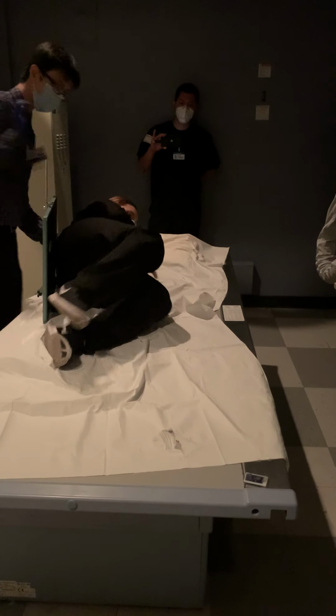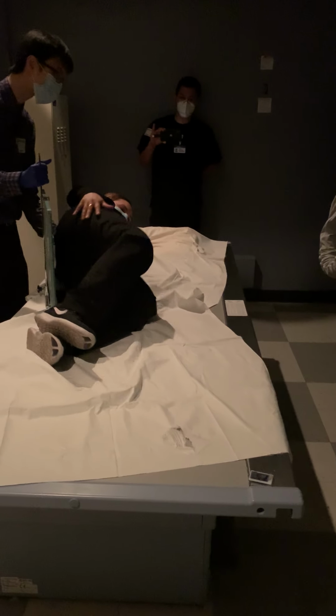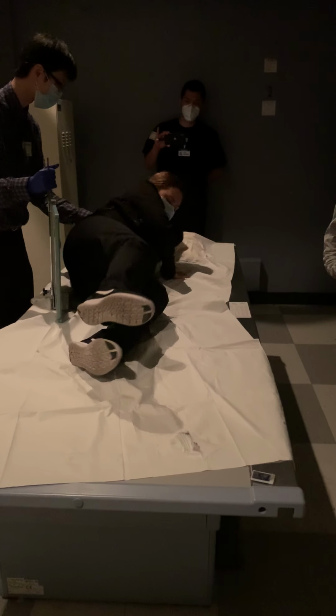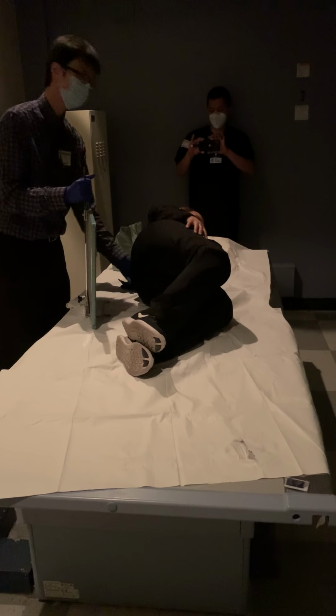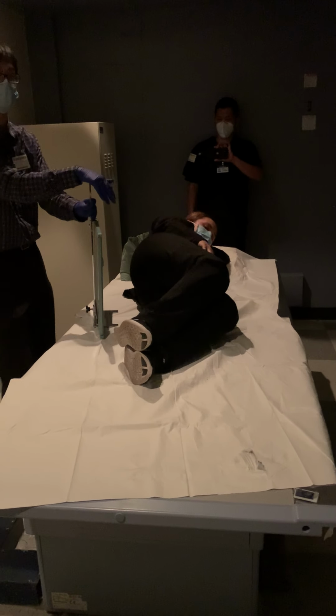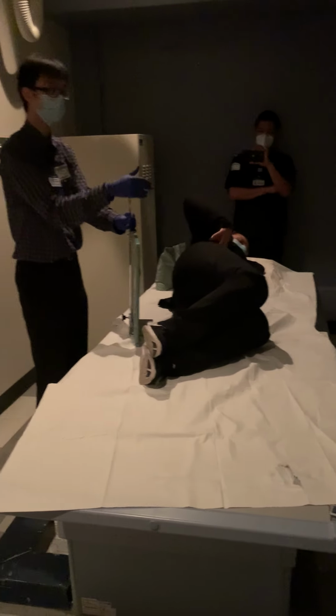Okay, it's good forwards. No, good forwards. Right in the middle. Right in the middle. Okay, keep going, keep going, keep going. Good. So, left lateral decubitus is preferred.